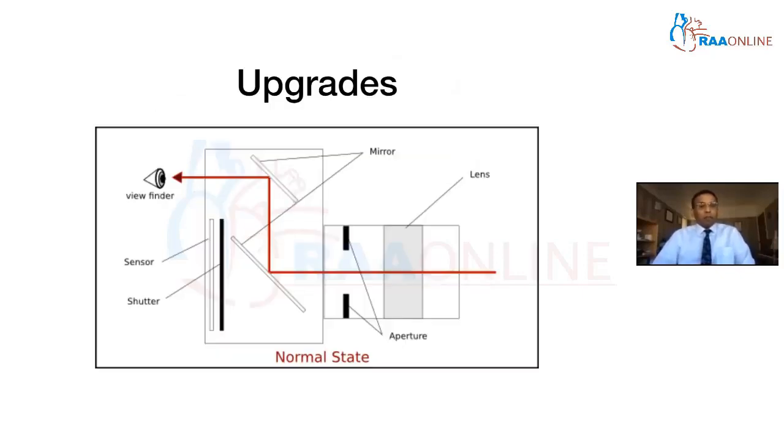Okay, it's all fine being able to see things, but how about storing those moments for review later in time? And also, how about being able to observe what the image I'm going to be capturing on a film and store it later? Now, the quest to be able to see the happenings around oneself and also inside a closed chamber has led to various innovations. After various trial versions, the upgrades came in the form of cameras, which helped in seeing what was in front of the pinhole before capturing the image.